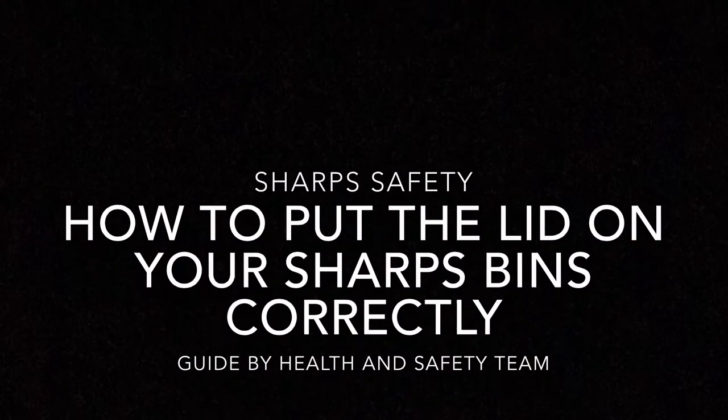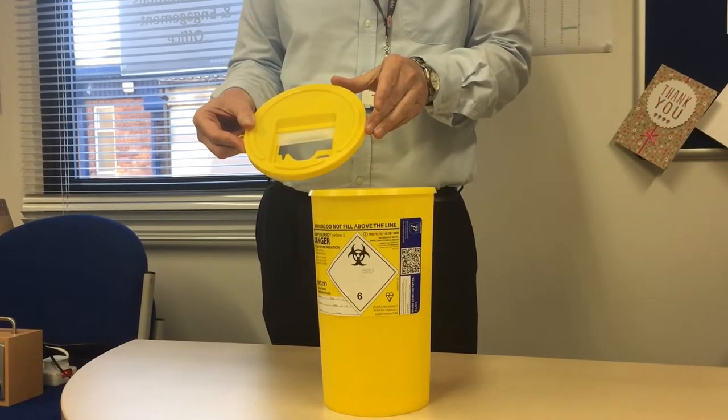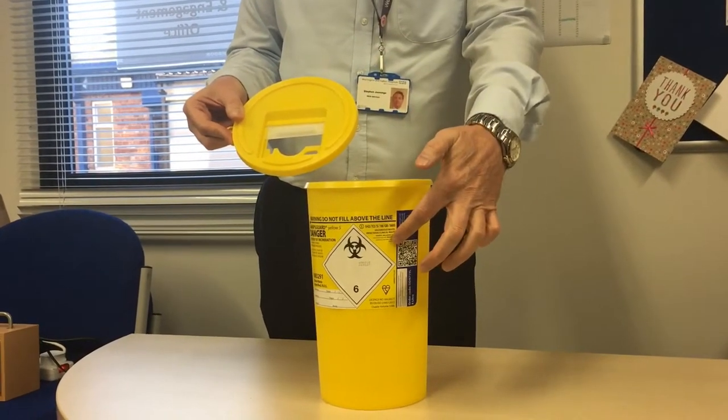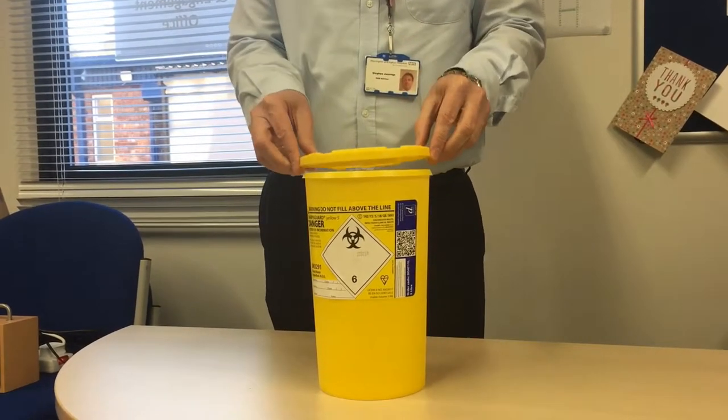When assembling the sharps bin, it is very important to ensure that the temporary open lid is in front of the label, or in line with the label. In doing this, you can see that the sharps bin is signed and also that the temporary lid is either closed or open.